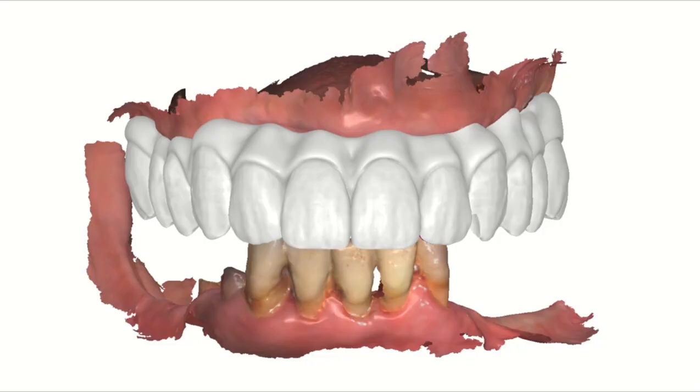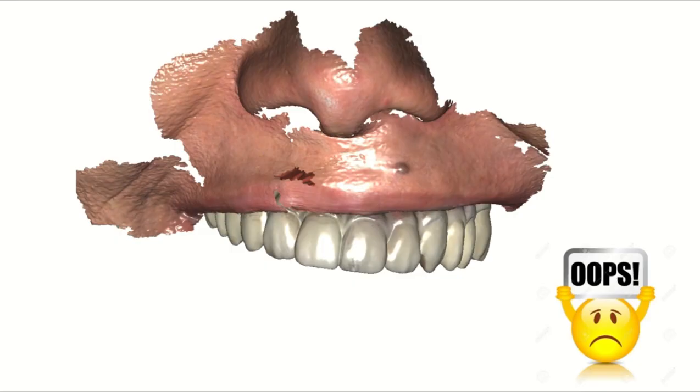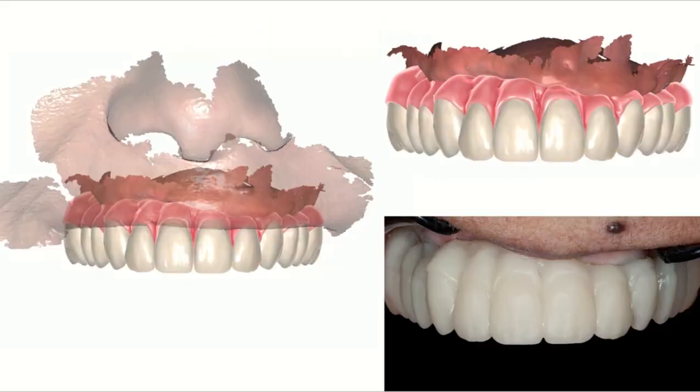We go back to our case. We designed our procedures virtually, but we don't know if it is the right maxillary orientation or not. And guess what? In reality, there is a surprise. Bad news. It is not the correct maxillary orientation. So we made a face scan with our Oral Scan 3. Of course, at the time, MetaSmile was not produced yet. We readjusted our work in the correct orientation to manage the discrepancy.